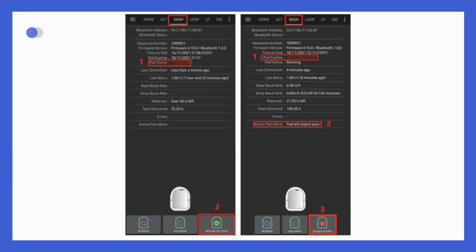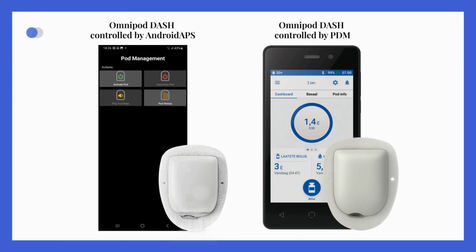In certain situations, a third button may appear in the Dash tab. This can be the resume delivery button or the silence alert button depending on the circumstance. The resume delivery button can restore insulin delivery after a profile change, while the silence alert button silences alarms related to pod expiration or low insulin reservoir. The appearance of these buttons provides specific options for addressing pump-related issues. These buttons are intuitive and serve as replacements for the functions performed by the Omnipod's Personal Diabetes Manager, or PDM. Although the PDM is not needed if you are using AndroidAPS, it is recommended to keep it as a backup device.